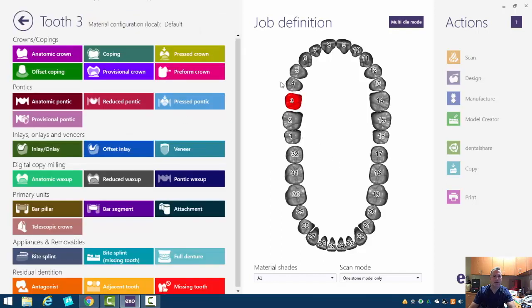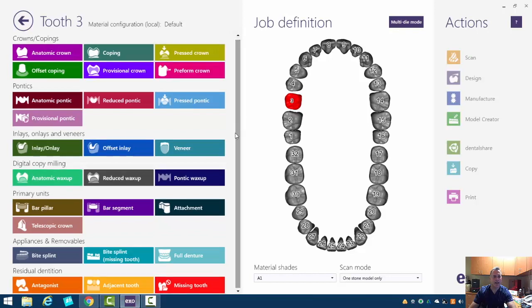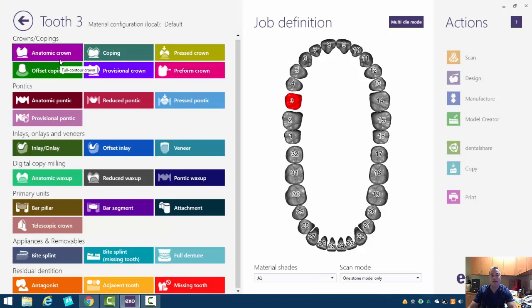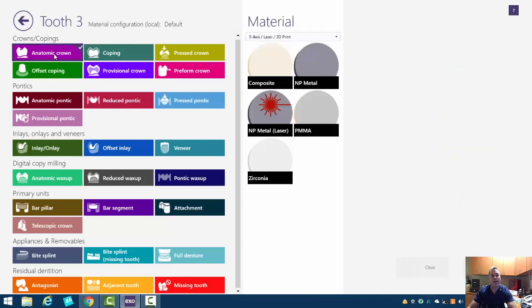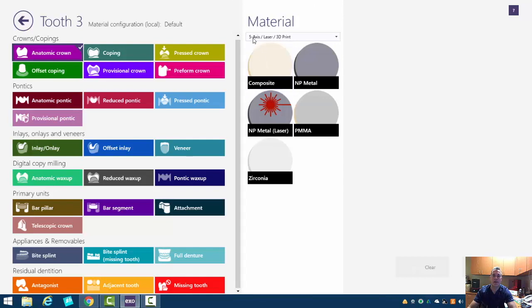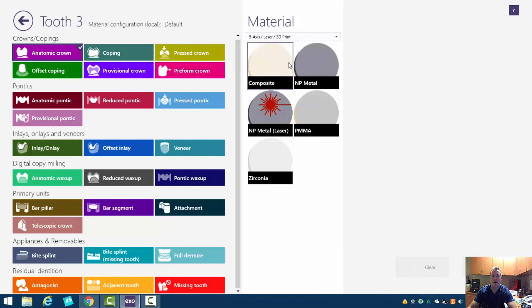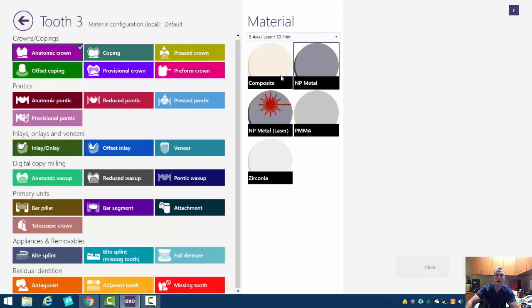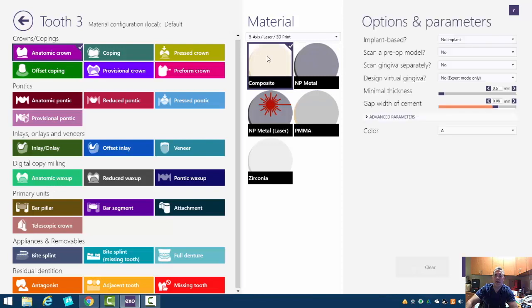So we're presented with a bunch of options to do. In this case here, we're going to be doing an anatomic crown. So an anatomic crown is something that's not cut back. And if we click that, we're presented with a bunch of material options and also five axis laser and 3D printing will be the way that we're going to make this. So just click on composite or whatever you want.